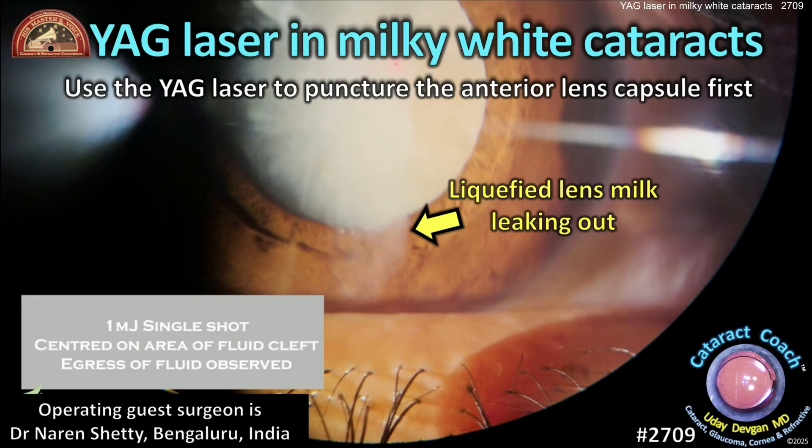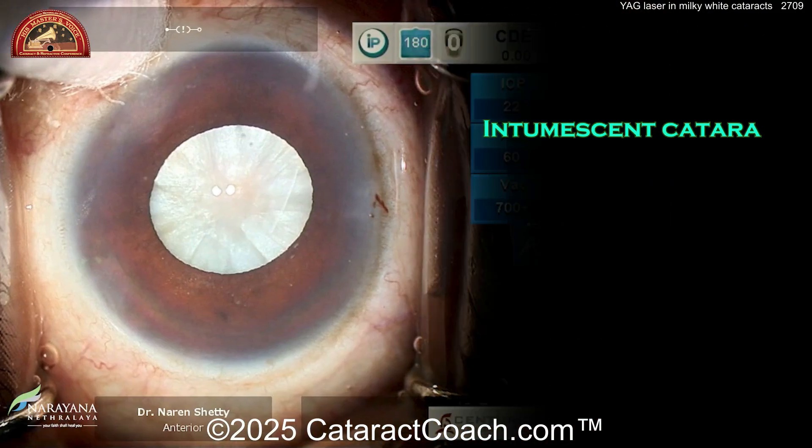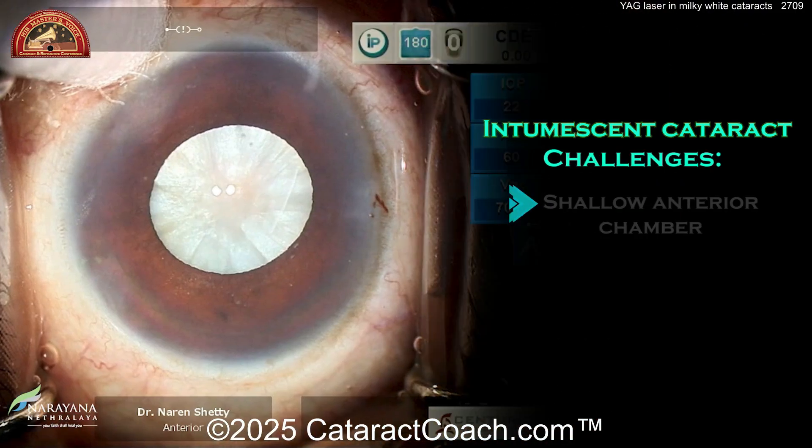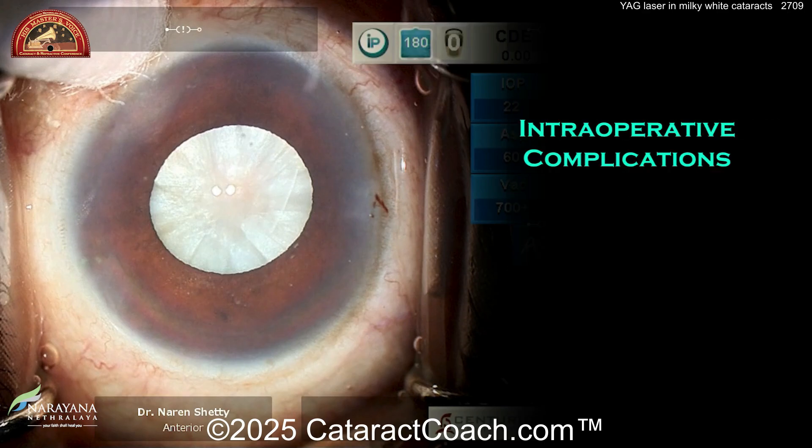You can use the YAG laser before surgery to puncture the lens capsule and let out that fluid to decompress the bag. Here's the challenge: white cataracts that are intumescent have a fluid-filled bag, shallow anterior chamber, and increased intralenticular pressure.